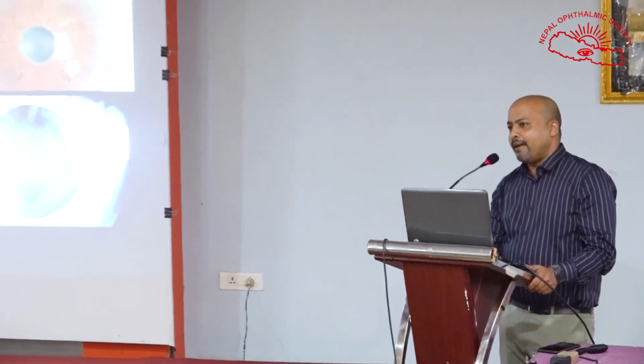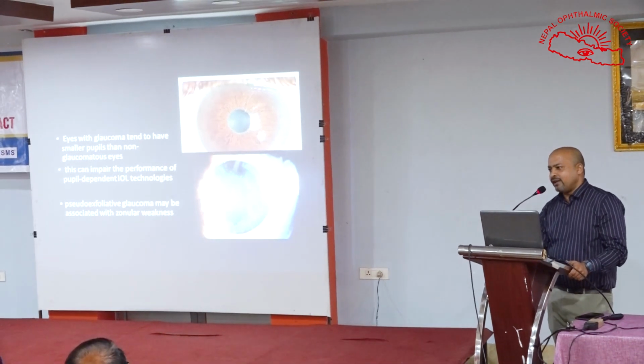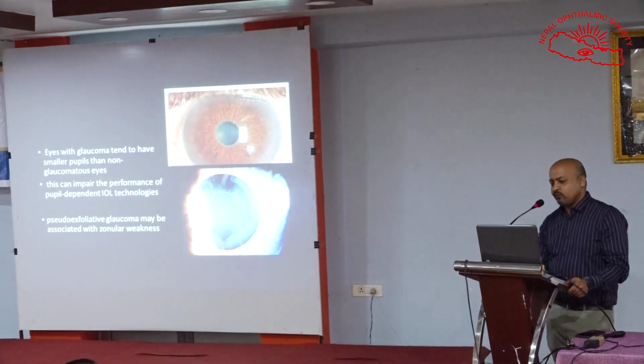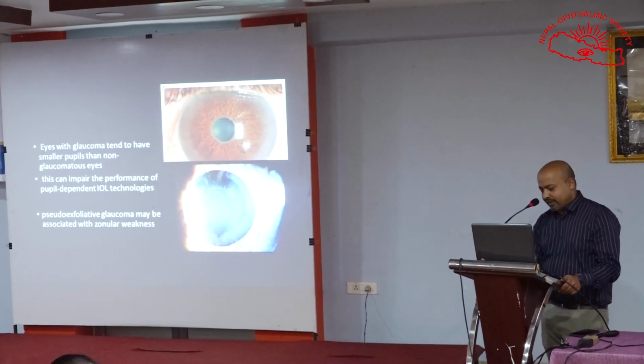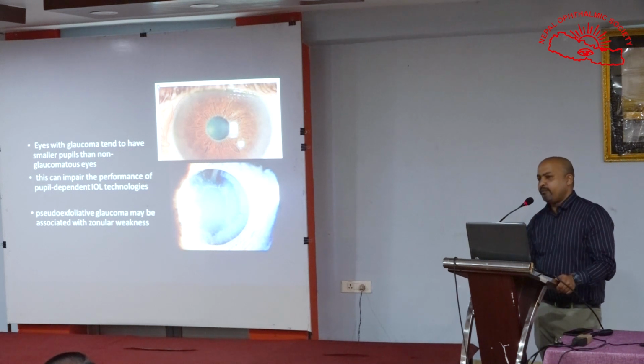Other important changes are that glaucoma patients usually have poorer pupillary dilatation than non-glaucomatous patients, and so this may hamper the performance of pupil-dependent IOL technology, especially in old age multifocal IOLs. And still in our part of the world, we do a lot of multifocals, so we have to be quite careful. Another important change is pseudoexfoliative glaucoma, which is associated with poor pupillary dilatation and zonular weakness, and this may require a CTR intraoperatively, which may have gone unidentified during pre-op evaluation.